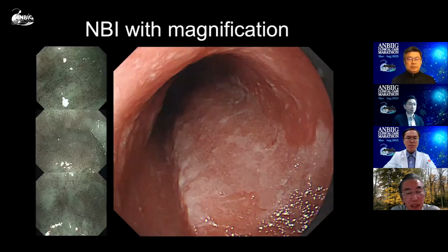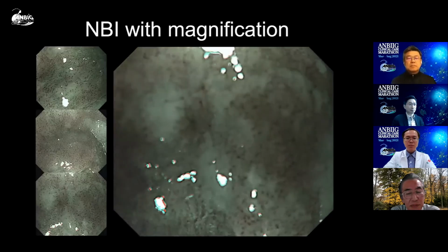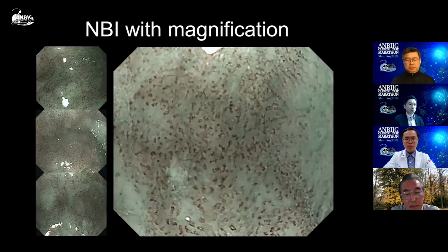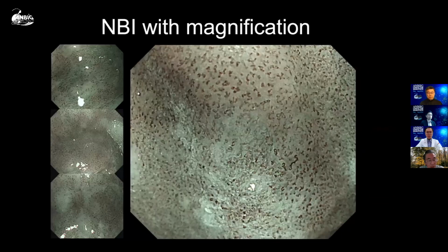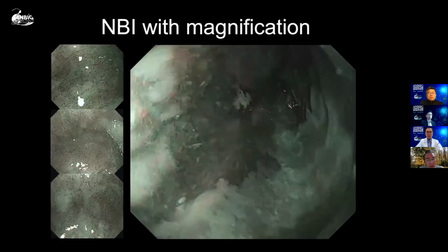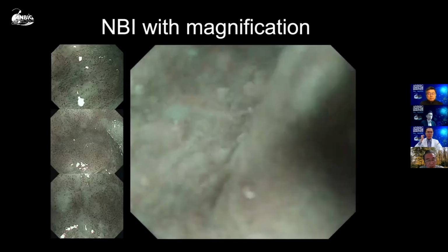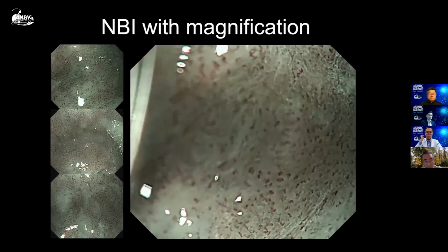After observing the lesion with NBI, I switch to the magnification function. It's not easy to use the magnification function because it needs a stable hand. A special short black cap could help endoscopists to stabilize the vision and check the IPCL.